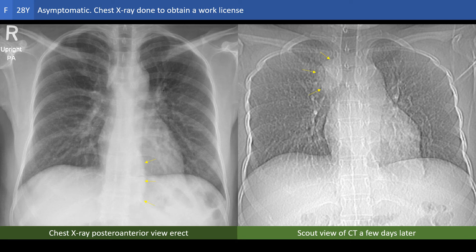Welcome to the body imaging cases. This is an asymptomatic young lady who had a chest x-ray done to renew her work license. The chest x-ray showed a left paravertebral shadow. CT was ordered to clarify this abnormality, and here we see side by side the chest x-ray and the scanogram of the CT. The quiz is how to explain the striking differences between the two images.